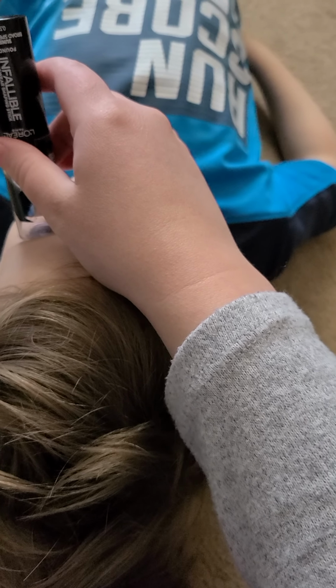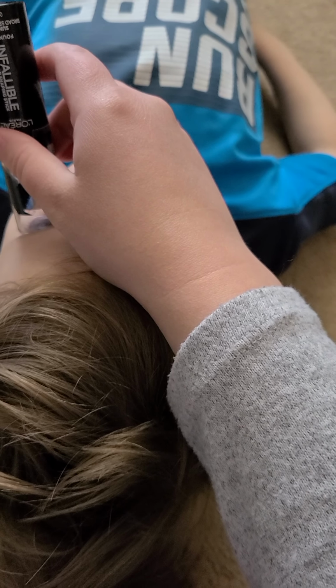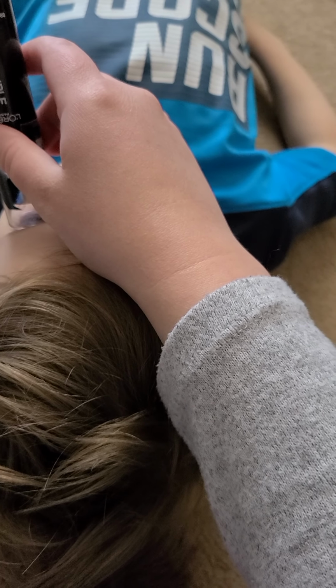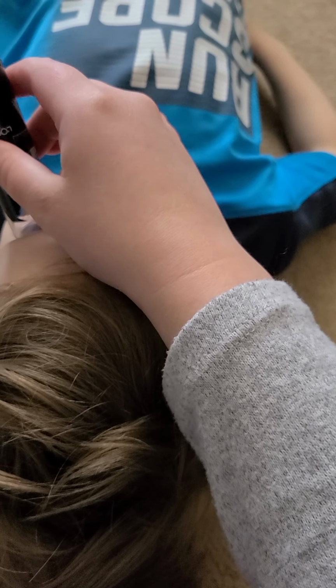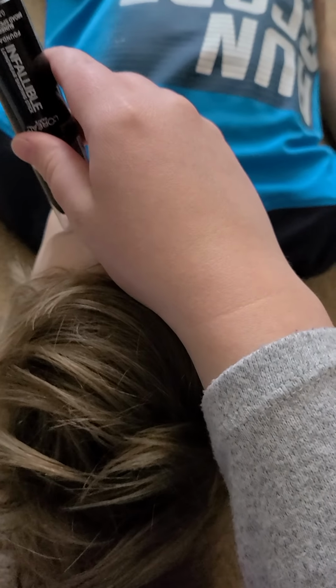The ophthalmic is the first branch off the ICA, and it feeds oxygenated blood to the vessels inside of the eye's orbit, as well as muscles in the face and part of the nose. And the siphon does the same thing. It feeds different portions of the face with oxygenated blood.